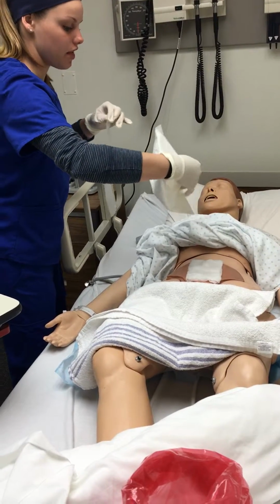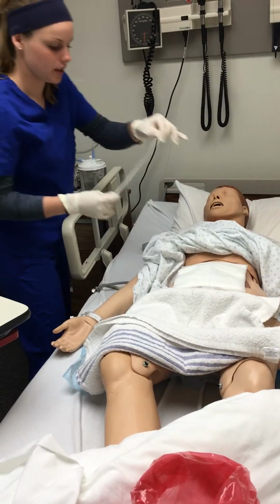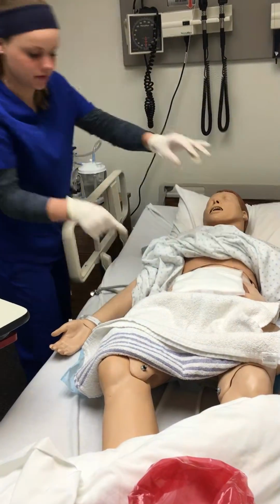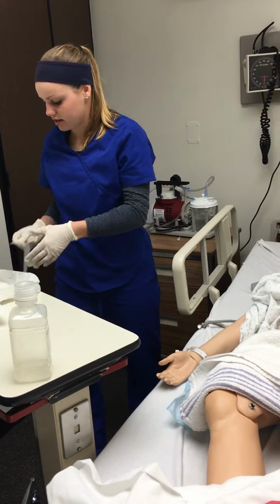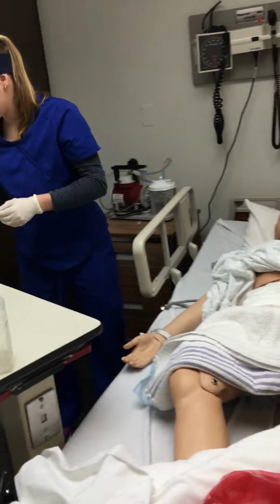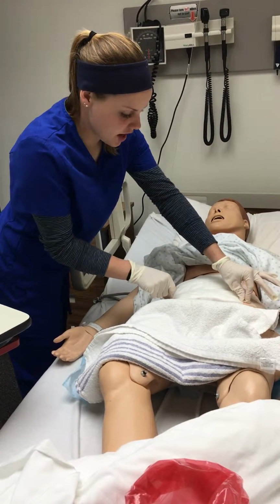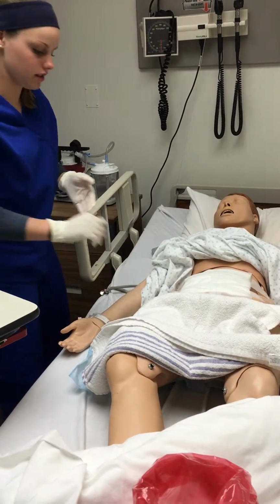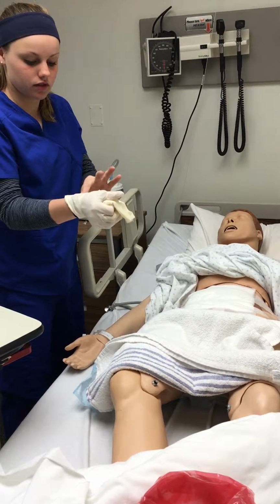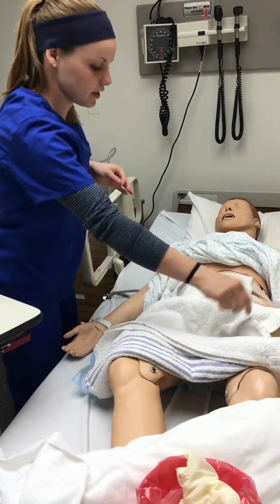I actually would have put it on this way. I had it laying down on the wrong side. So the blue line would face up. We're going to tape down that gauze, or the pad. Now that her pad is secured, I can take my gloves off and put those in the biohazard container. We can take this off.